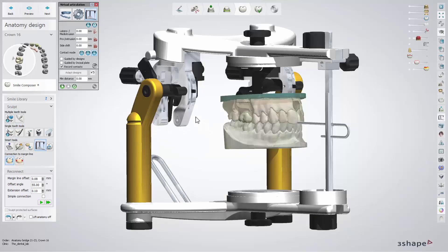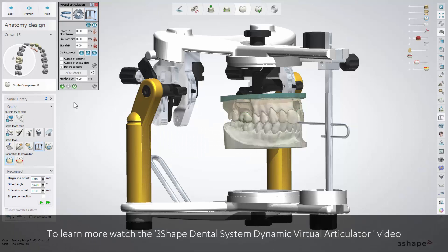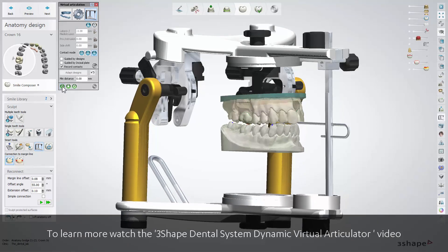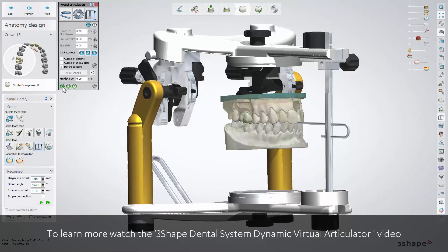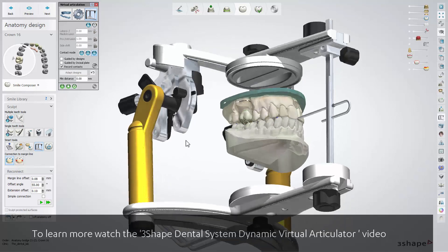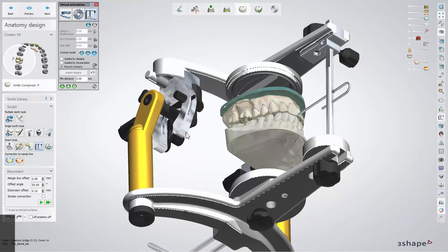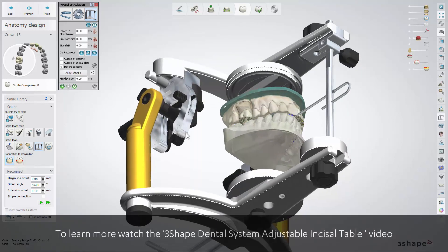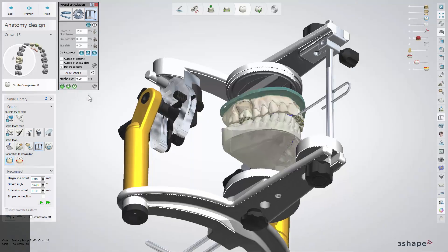Virtual Articulator. If you want to learn more about our Virtual Articulator, watch the 3Shape Dental System Dynamic Virtual Articulator video, as well as the 3Shape Dental System Adjustable Incisal Table video.